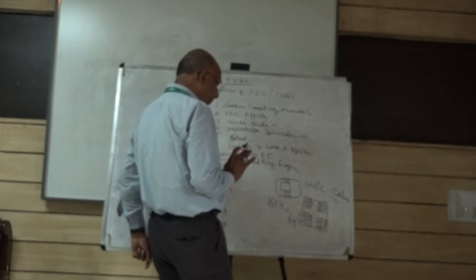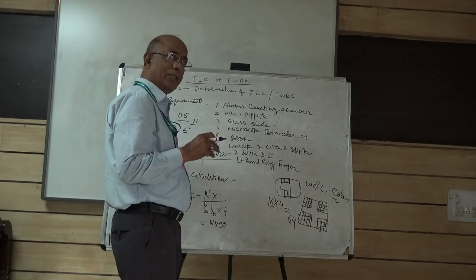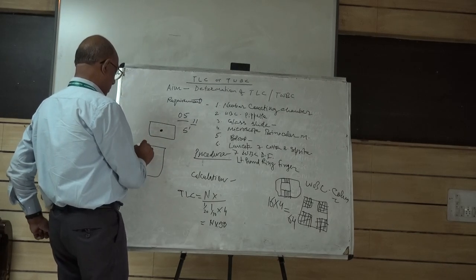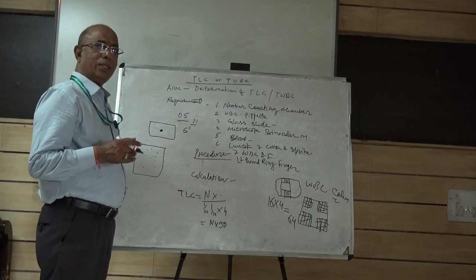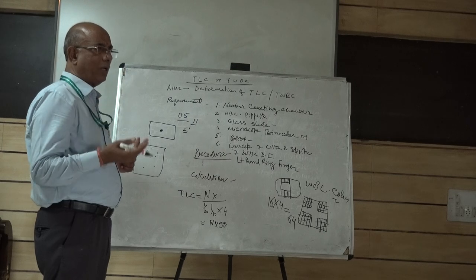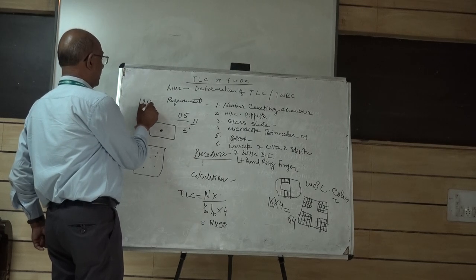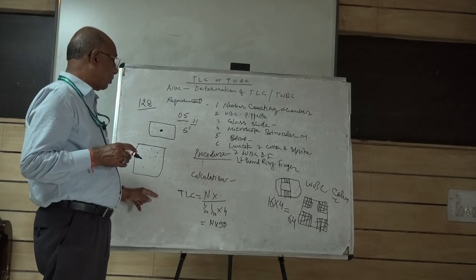These 16 squares multiplied with the four columns give 64 sub-squares in total. Out of that, we see the dots, which are the WBC cells, and we count them. Each column means 16 squares, in column number 1, 2, 3 and 4. Out of that we calculate, say for example, 128. The total number of cells is 128, and we take it into the calculation.